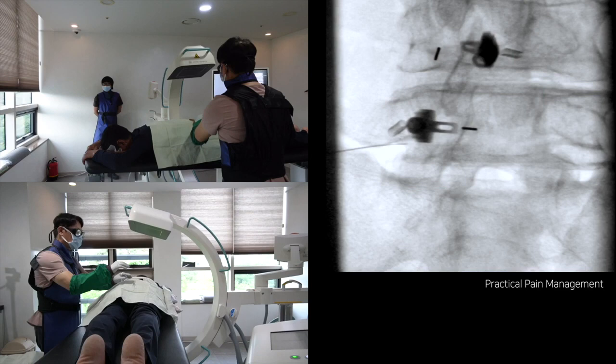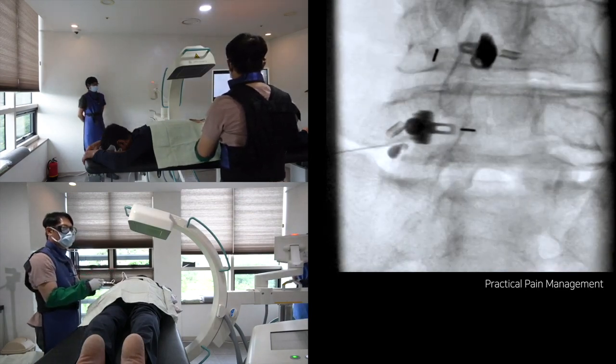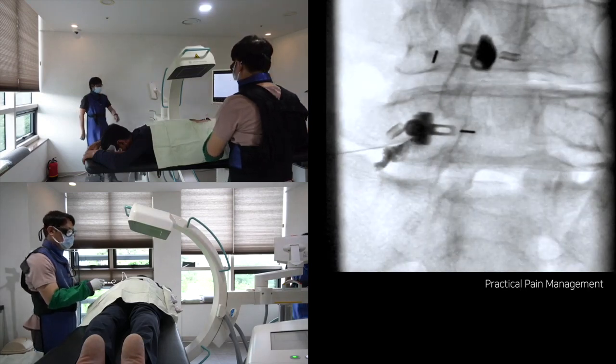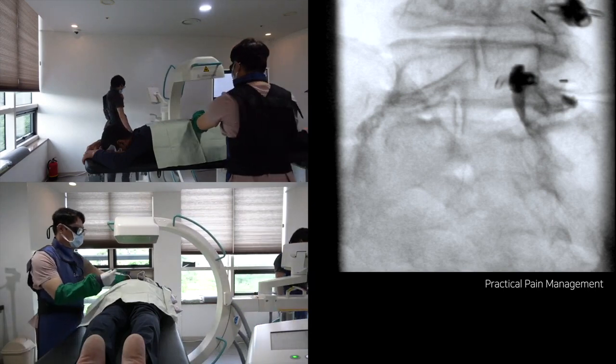It is close to the ideal target. Always warn the patient of the infusion of the fluid and ask for the patient's feedback. The contrast spread looks good.